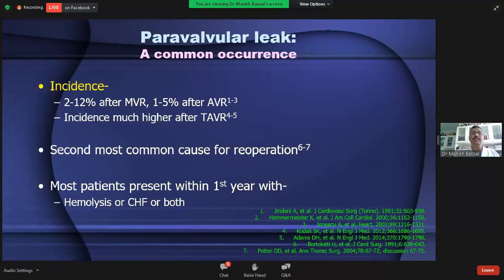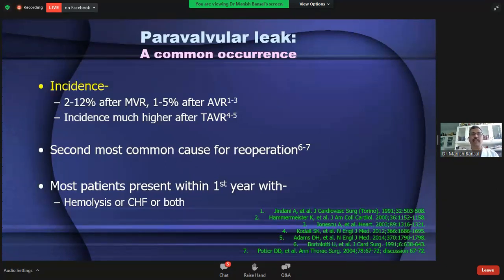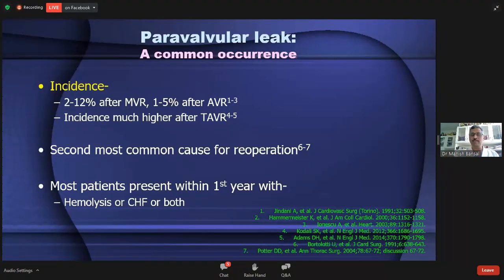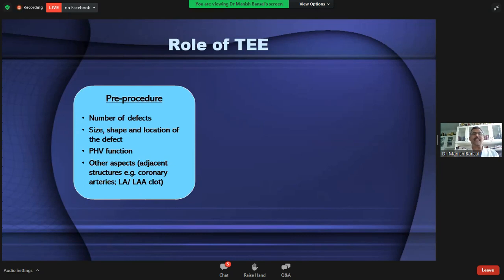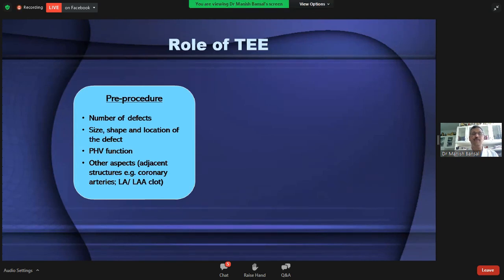The first example is paravalvular leak closure. Paravalvular leak is one of the most common problems after valve surgery and is actually the second most common cause for re-operation. However, re-operation in this setting is challenging because most patients present within the first year of surgery, making early redo surgery unacceptable for both patient and surgeon. Therefore, paravalvular leak closure by device becomes the natural choice. Pre-procedure assessment must define the number of defects, their location, size, shape, prosthetic heart valve function, and other associated anomalies relevant for planning.